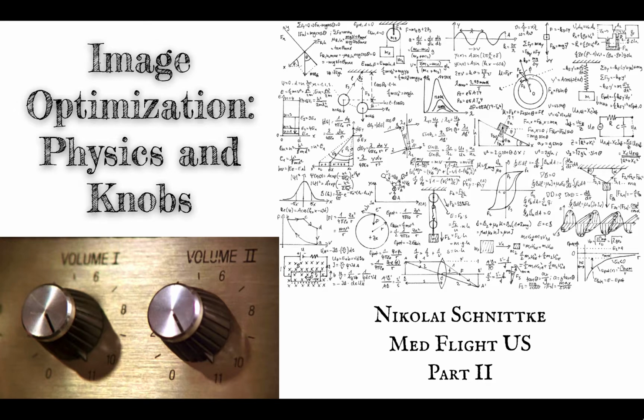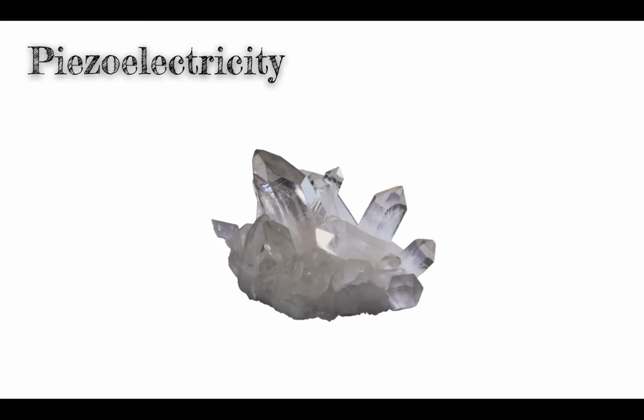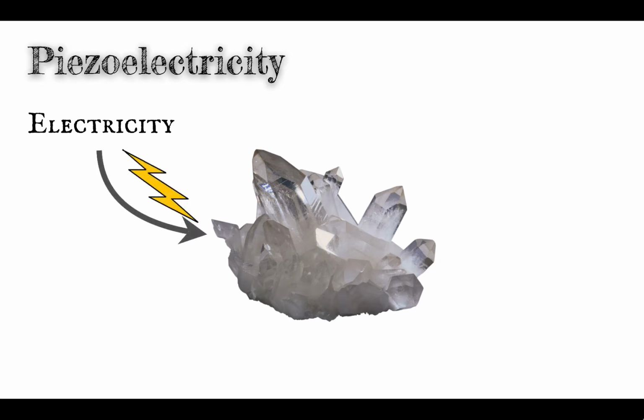Last time we talked about how the Titanic disaster caused people to think about how to use sound waves in order to see faraway objects. But how are those sound waves actually emitted? Sound emission is based on the property of piezoelectricity. Some materials, like quartz crystals shown here, have this property, which means that when hit by an electrical current, they vibrate and emit sound waves.